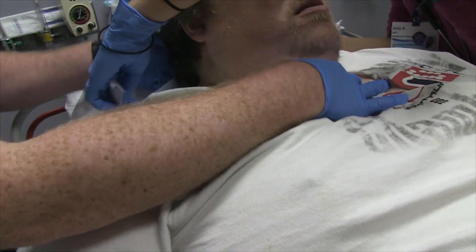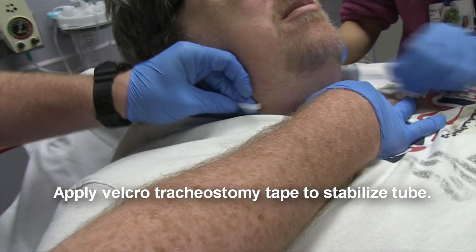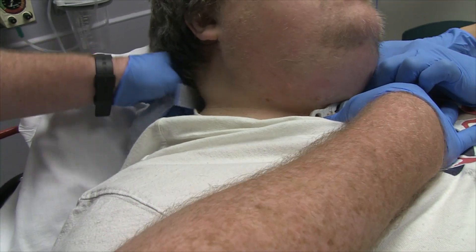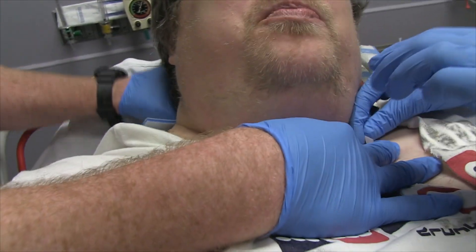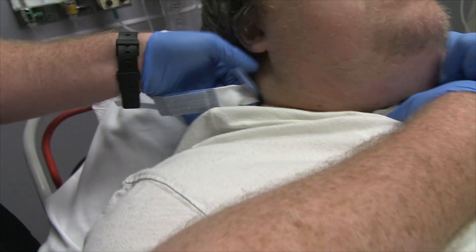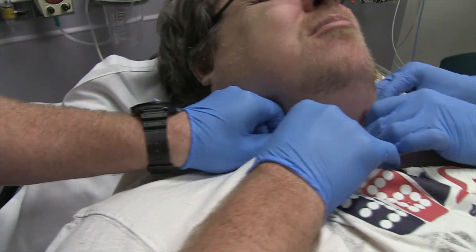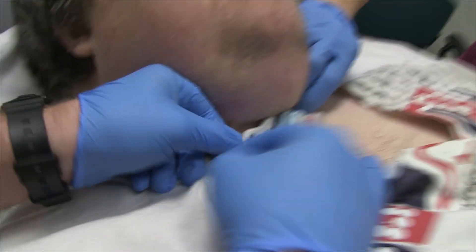What are the tricks to tying it on — hooking it on? There are these two little velcro parts right here, and just come on down. Hook it through here. Awesome.